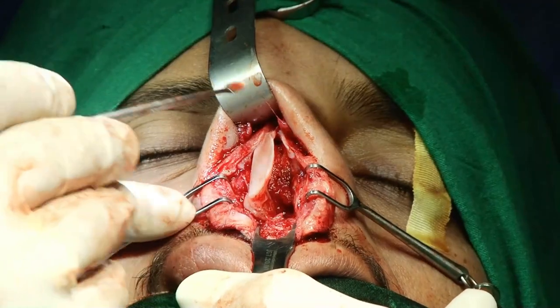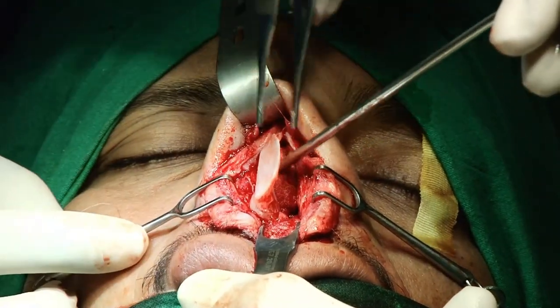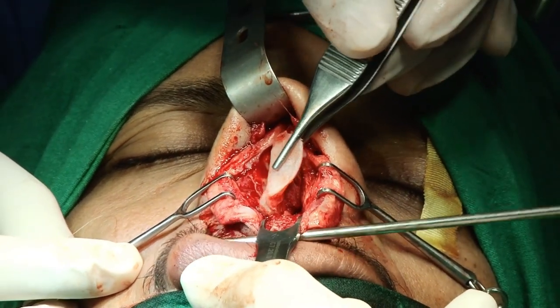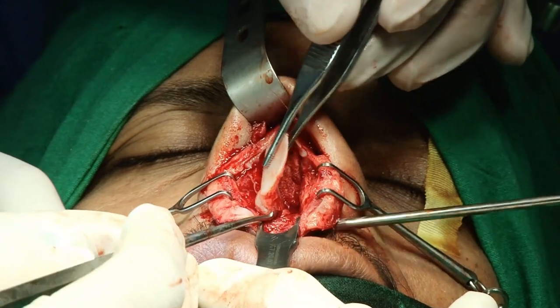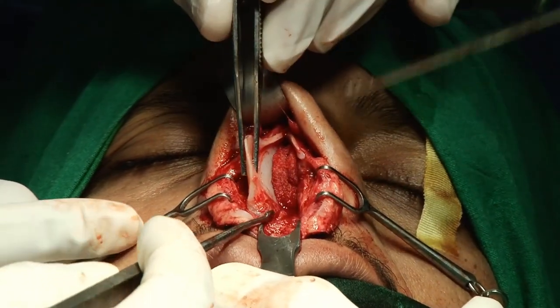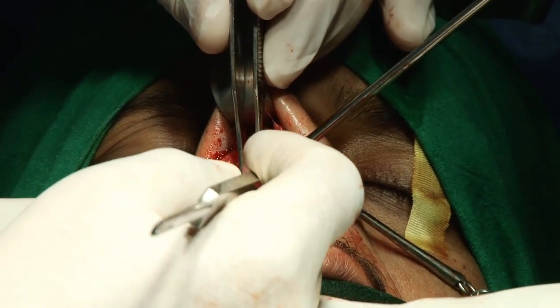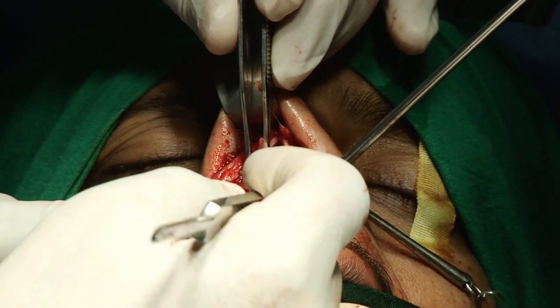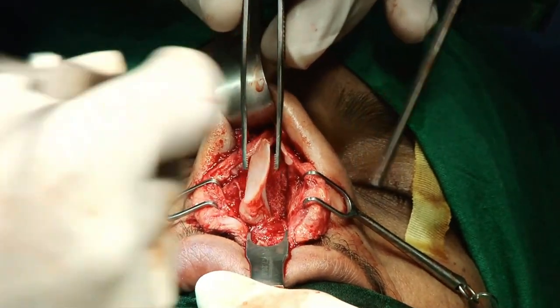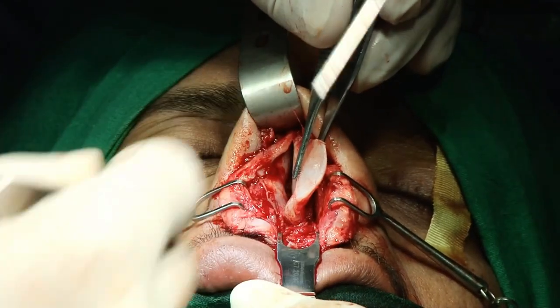So basically this is the dorsal part of the septum, this is the caudal part of the septum. This is deviated on this side, and this basal part at the posterior septal angle comes on this side. So the septum is badly deviated due to the trauma. In such a patient, when you're degloving your mucoperichondrium, there is a lot of bleeding chance. So it's very important to put a pack on this side and one pack on this side, and then you deal with your septum.